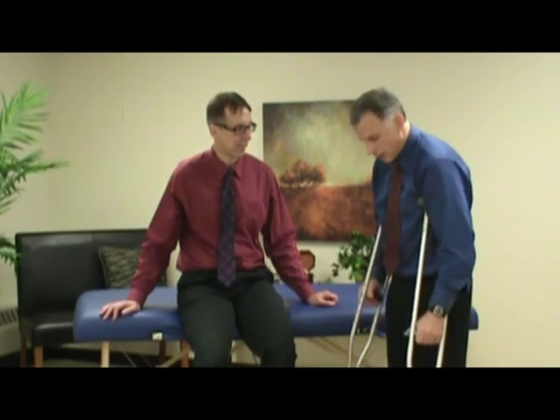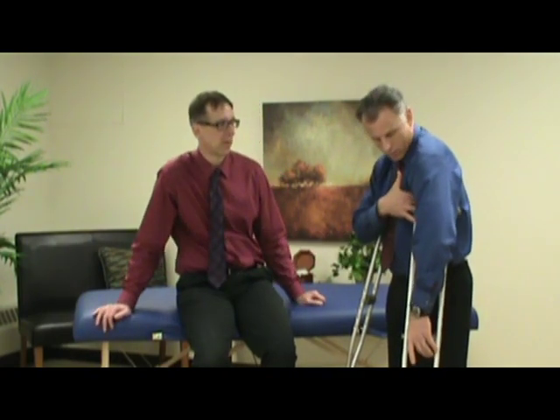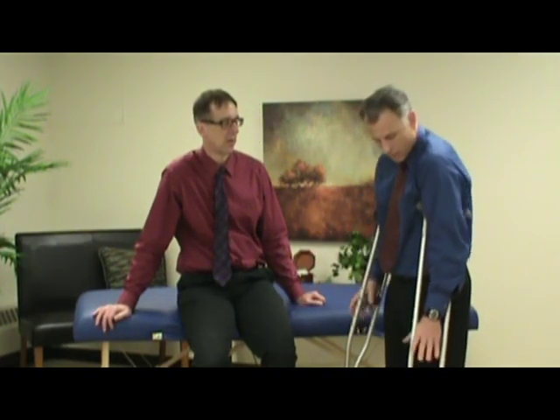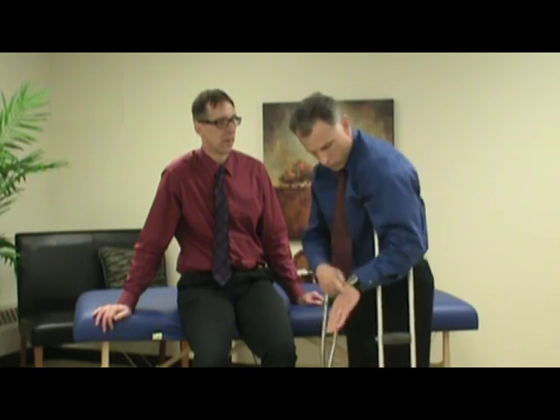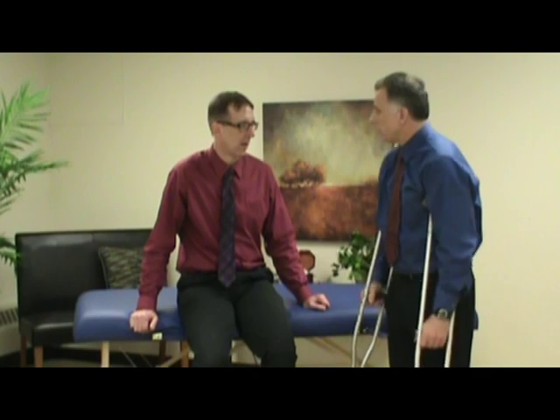Now the weight of your body goes through your hands. So as I'm walking here, you can also squeeze them in, so you've got stability, but the weight goes right through here. And squeezing. And squeezing together.